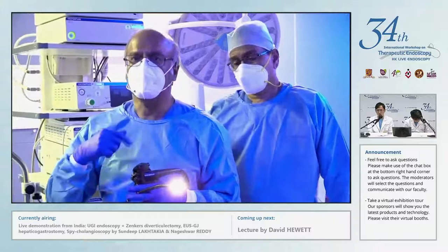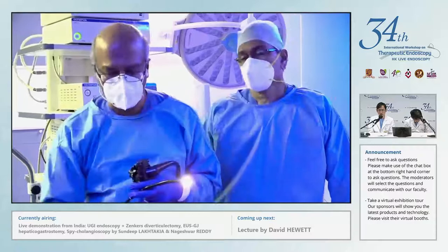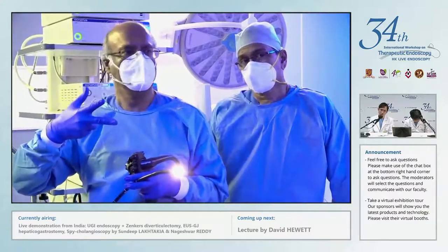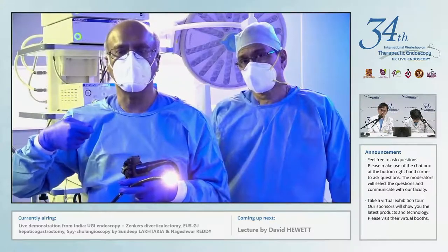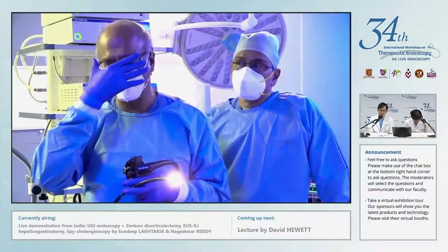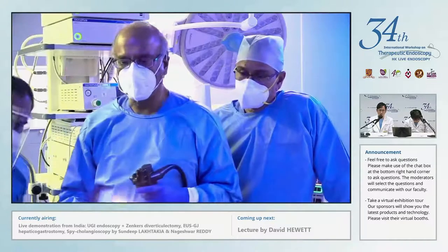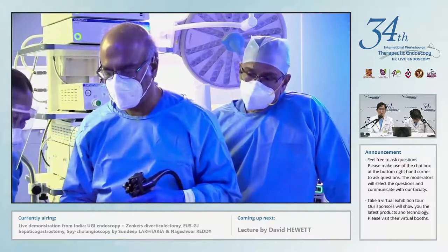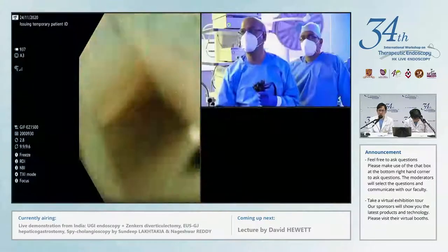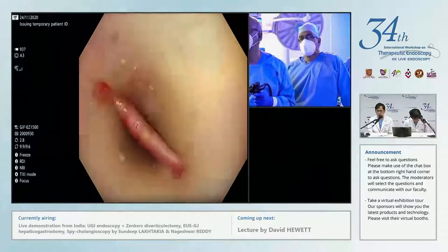The patient is intubated, but we have what is called the diverticuloscope, which is available from Wilson Cook, actually made by Jack Daver and his group, which has got a slit inside. So what we would do is to put the diverticuloscope first on the endoscope and fix the diverticulum, then the procedure becomes very easy. So we have already done that, and I'm now going to pass my scope through the diverticuloscope so that I can go in. And so I'm actually intubating the diverticuloscope. I go inside, and when you come to the diverticulum, you can see it nicely there, okay?